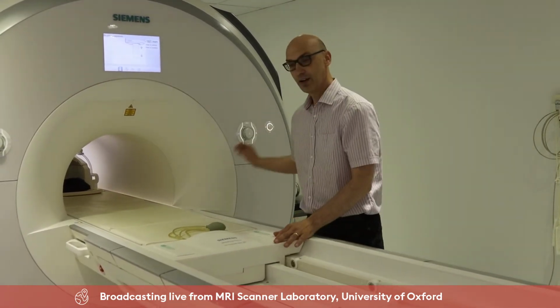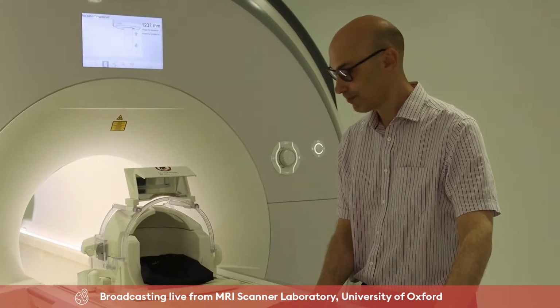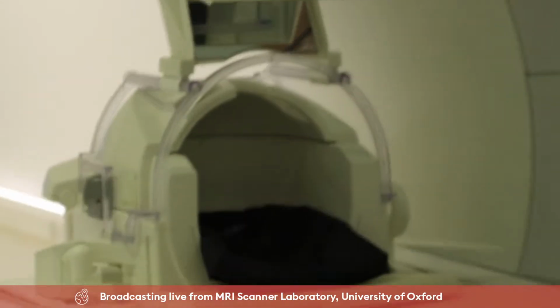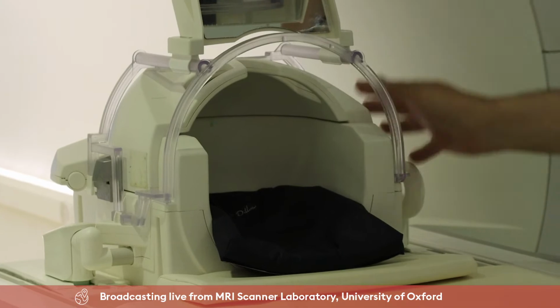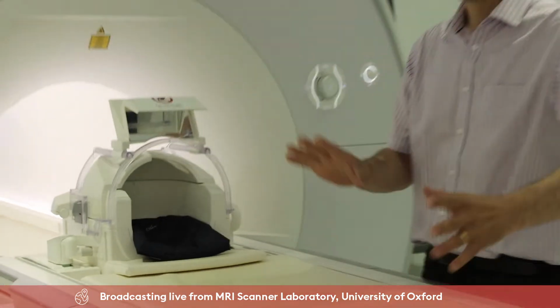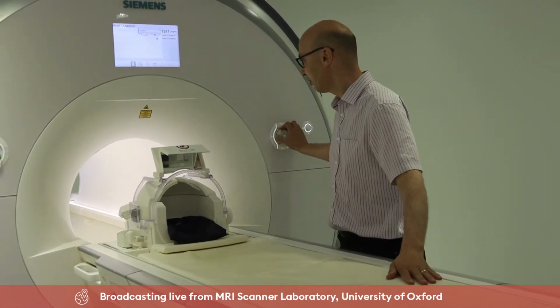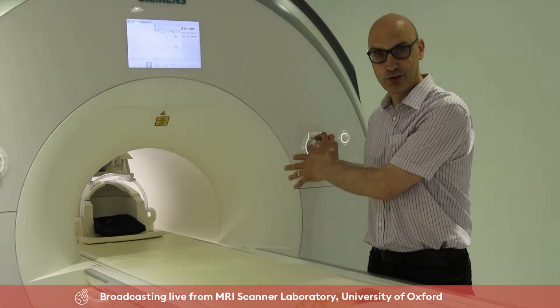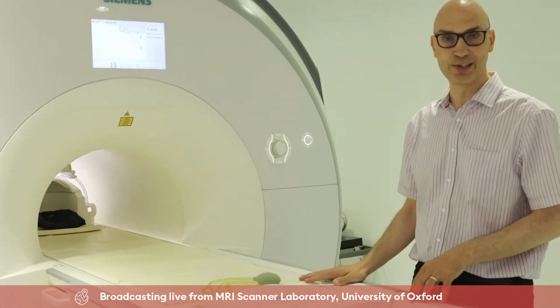So what we do to take pictures of someone's brain is we ask them to lie on this table here. They put their head inside this detector, which is really close fitting, which gives us the maximum sensitivity to the signals inside the brain. We get them to lie down, make them very comfortable, and then we put them right into the centre of the magnet, where it's strongest and most uniform. So we can start taking pictures inside their brain.